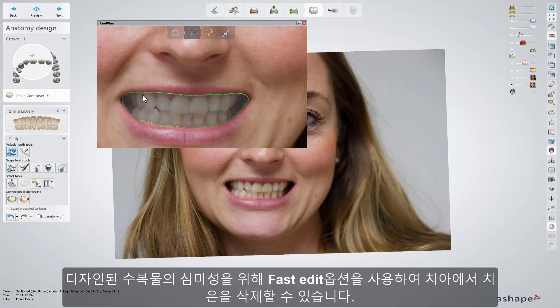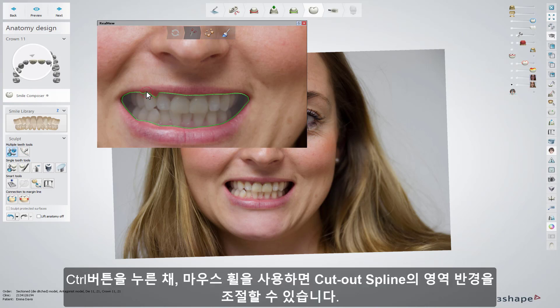For better aesthetics of a designed restoration, you can cut out the gingiva from the teeth with the Fast Edit option. Press Ctrl and scroll the mouse wheel to change the influence radius of the cut-out spline.